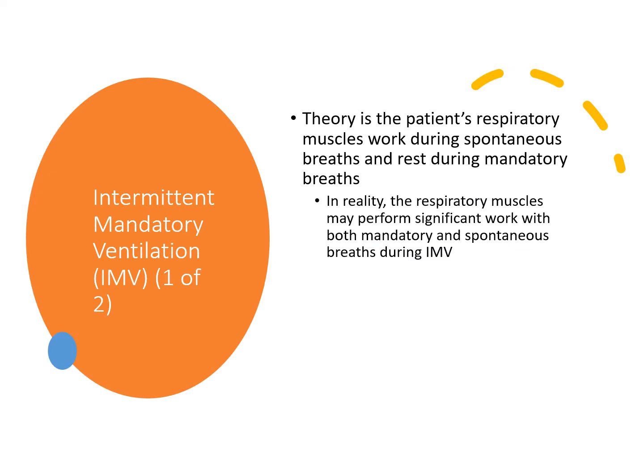So let's talk about IMV or SIMV. This first started way back in the 1960s. I know I say way back, but in the 1960s, usually this was most used for infants that were in RDS, or back then they called it idiopathic respiratory distress syndrome, right? So IRDS, if you will. So a little history lesson for you there.